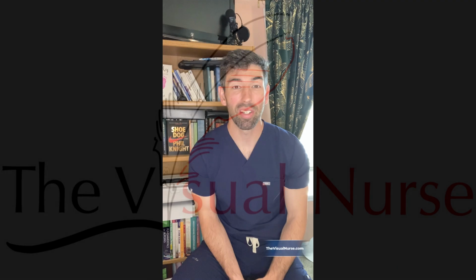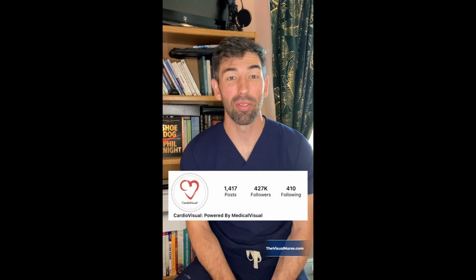September is Afib Awareness Month. I'm happy to team up with my friends over at Cardiovisual alongside the other awesome educators that you're seeing featured. Here, I'll be reviewing rapid identification of Afib on the ECG from a single lead basic rhythms and nursing perspective.